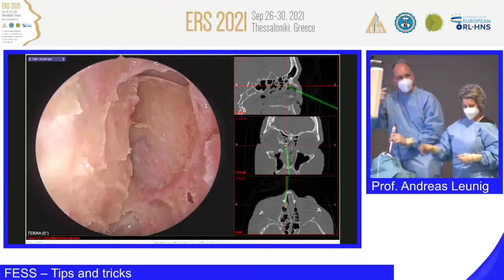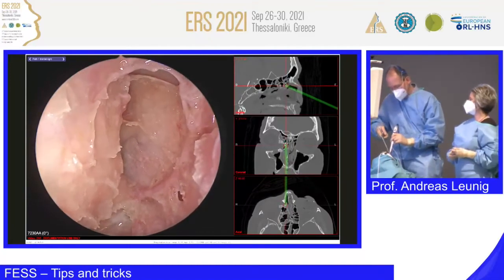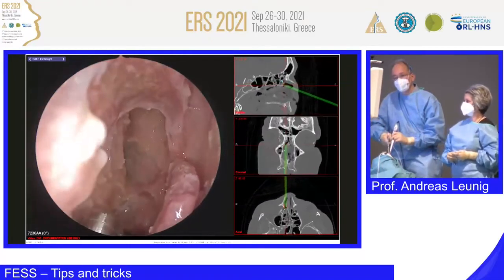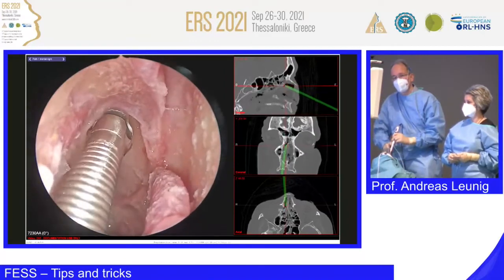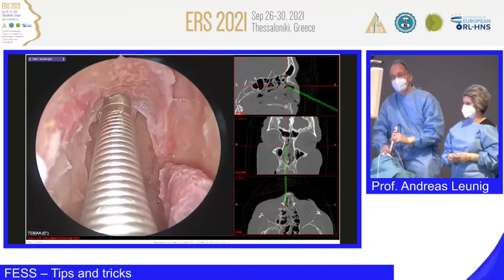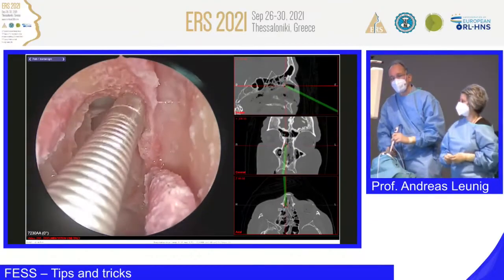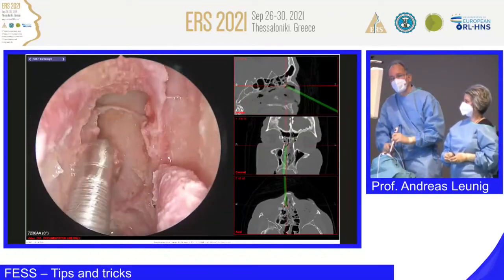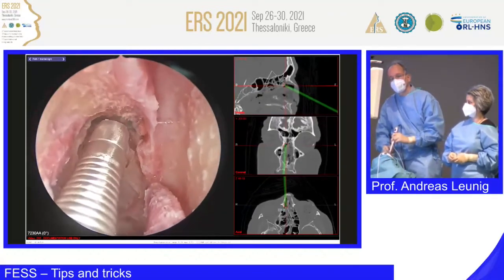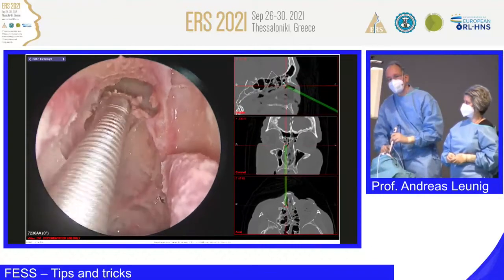There's another punch which is more aggressive. It's designed by Werner Hosemann. He's a very good rhinologist from Germany and has done a lot of work, and thanks for all his work. And now we can go here. And you can just make one bite, you make another bite, and I'm going up here again, and you see 3 bites.